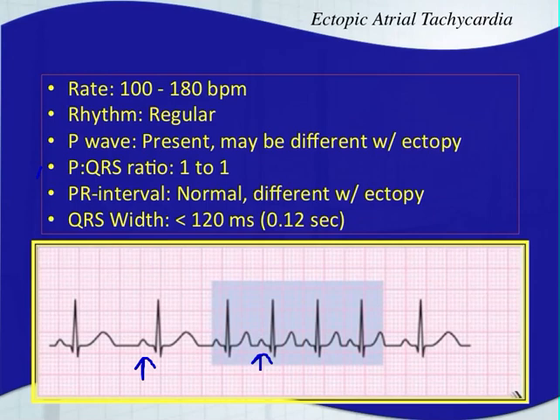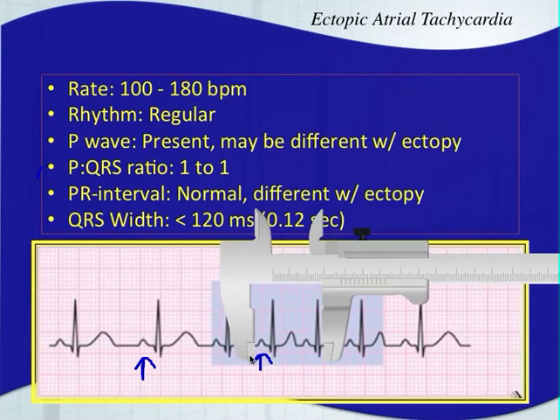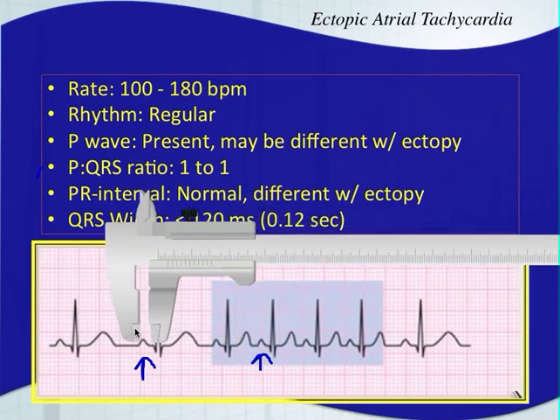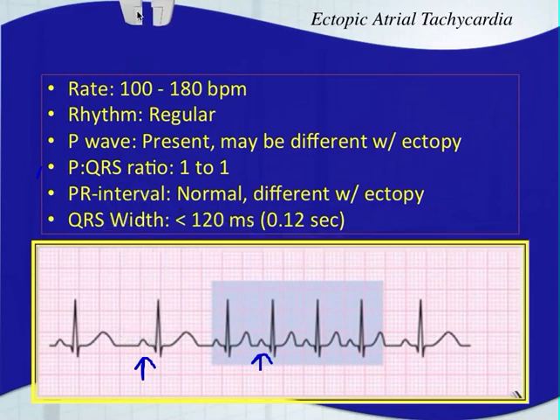The P to QRS ratio is still going to be one to one — you have one P wave for every QRS complex. Your PR interval is still going to be normal, but it's going to be a different PR interval with the ectopy. The spacing for this PR interval is going to be different than over here — the tachycardia is going to have a different PR interval, and that's how you know it's an ectopic atrial foci. Somewhere else in the atria, either the right or left atrium, is causing depolarization to take over. Your QRS width is still going to stay narrow, less than 120 milliseconds which is three small boxes.